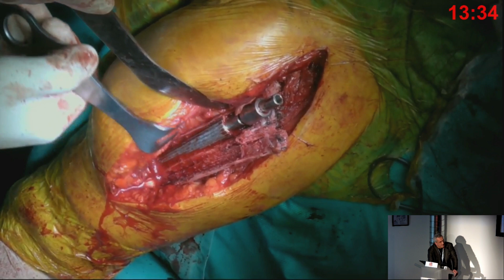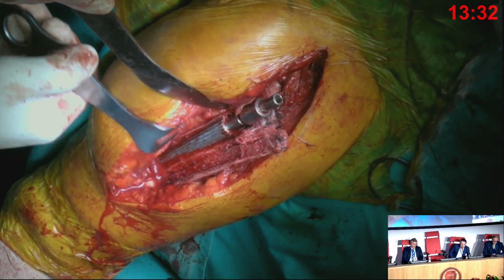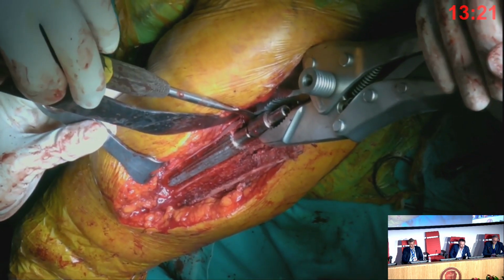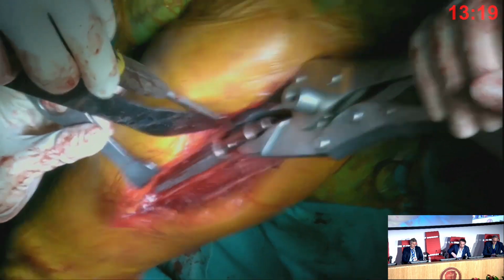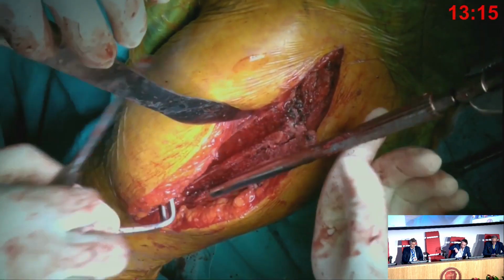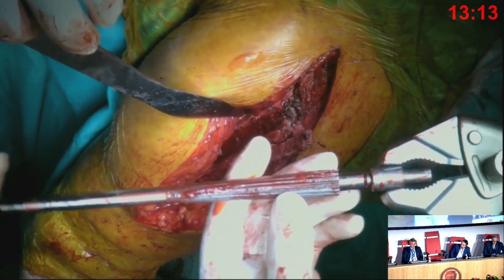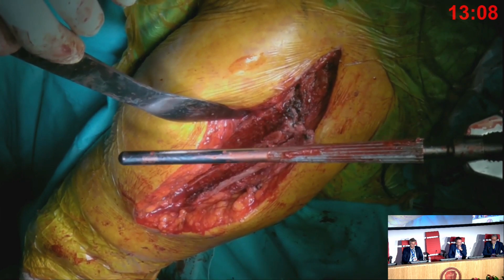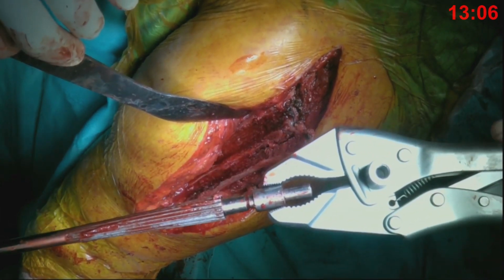Well, it depends where the cement is. In this case, you cannot just go all the way down because the stem is so long. Exactly. If the stem is a standard stem, and I needed an osteotomy, I don't struggle. I go farther down and remove the cement easily. If it is a very long stem, then I would just try to play around distally. But it depends on the size of the stem. Okay, thank you.